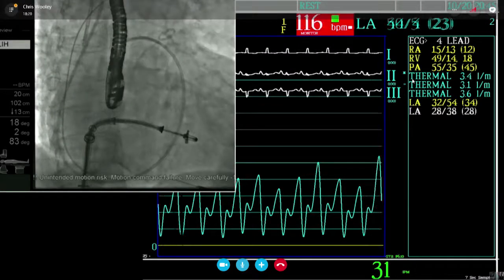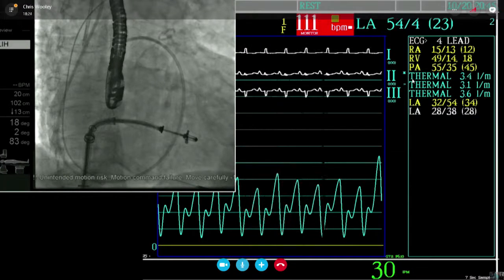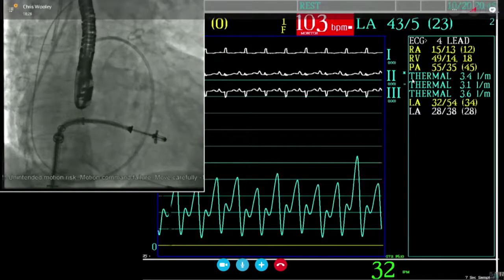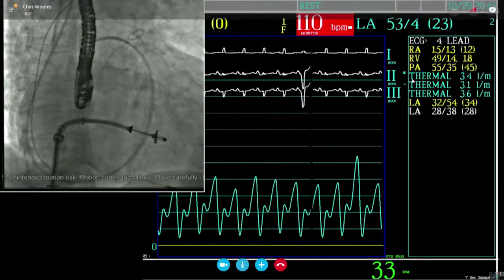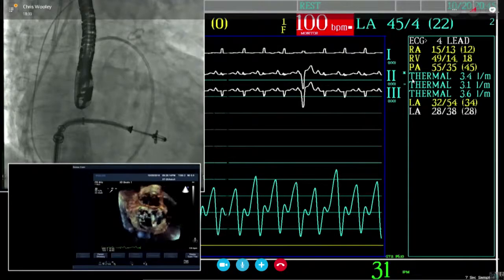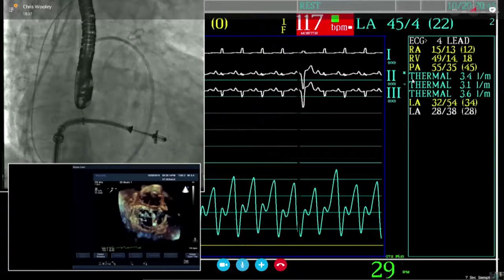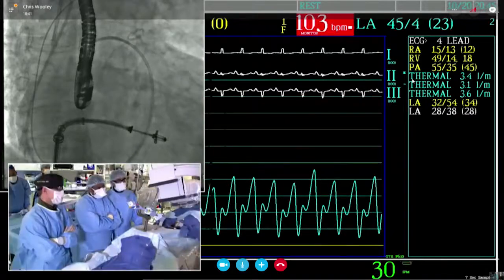Now, as you know, we've advanced the clip delivery system into the left ventricle. And as you guys described very nicely, we oriented the clip, and we're now below the valve. Now we're going to check it below the valve, and we think the orientation is good, right? So I think we're going to now go for the grasp.